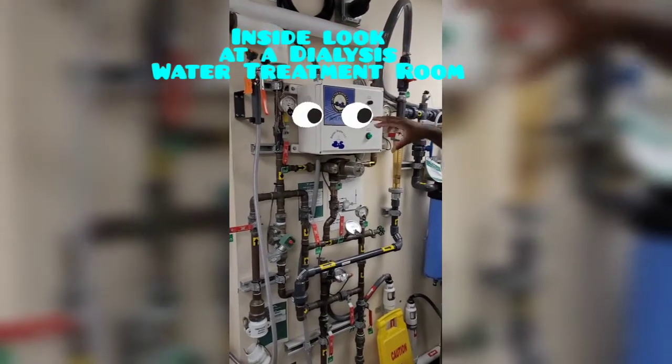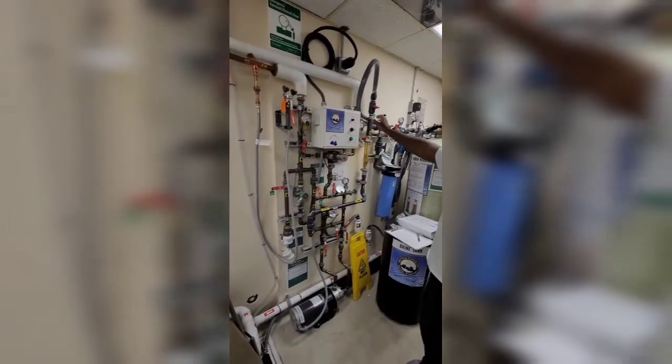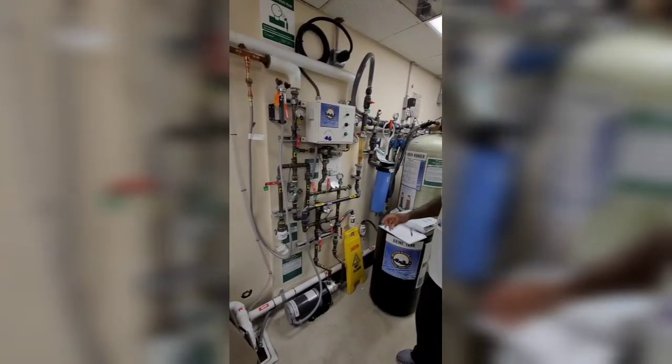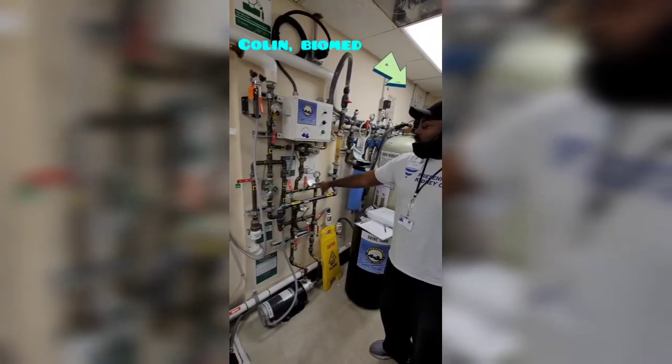Even the cold water comes in hot. So basically what I'll do in that time is I'll turn nothing but cold water on and put the hot water off. But nonetheless, we just got to keep it around 77 degrees, and they check that right there.